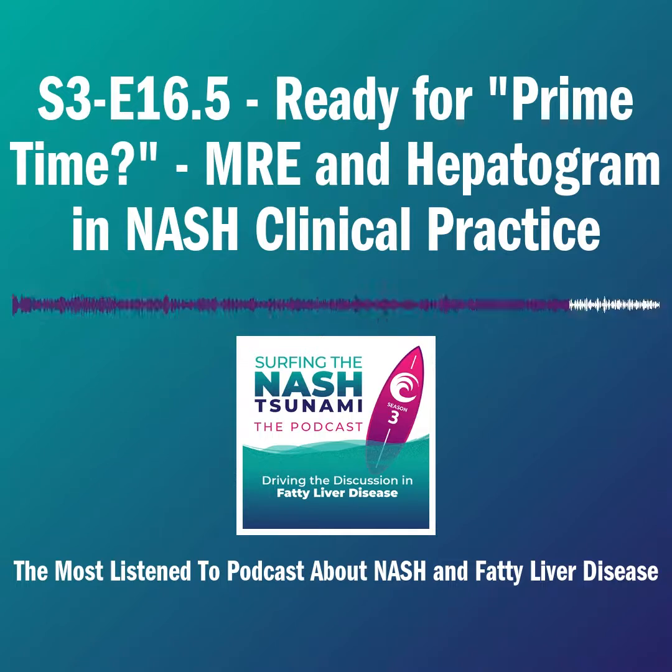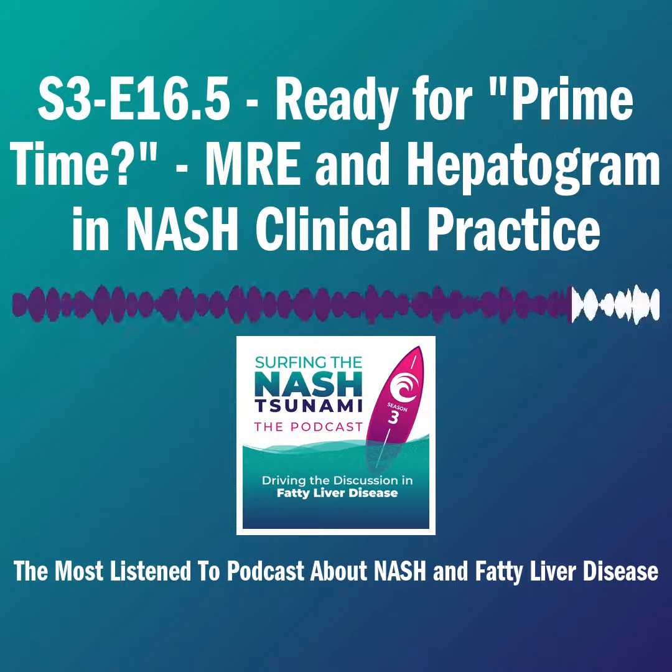MRE is in my practice and PDFF as well. I use it the same way that Stephen uses it. We're not going to jump on it as the first test. I think sequential testing became almost the standard, especially in those that know how to do NASH.